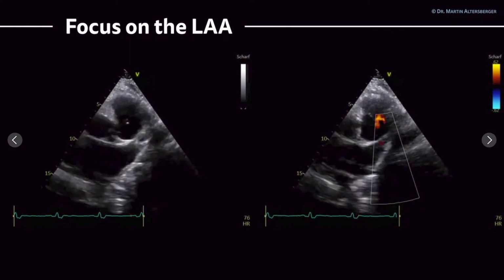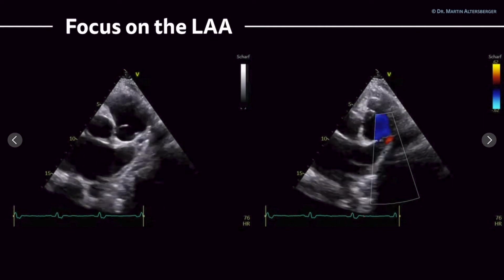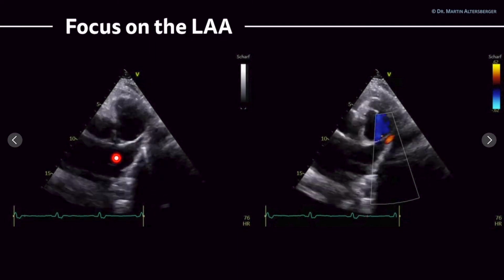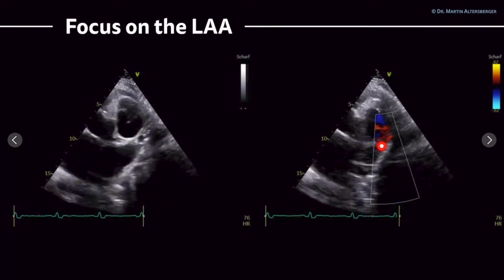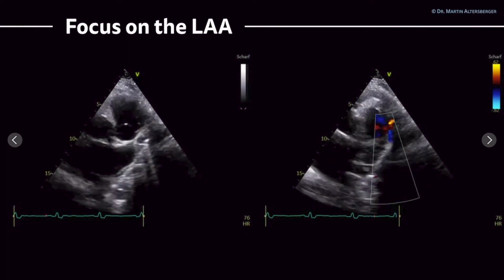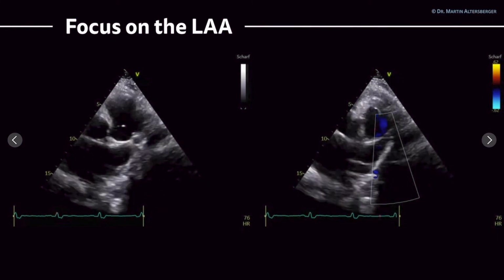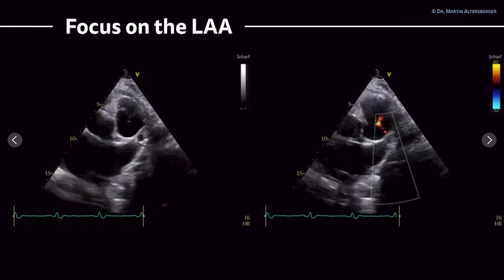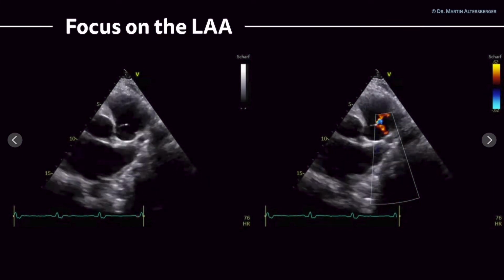And already you can see if a thrombus is present from TTE. More to focus on the left atrial appendage, so this is a specifically focused view where you can see bigger parts of the left atrial appendage, and you can use color Doppler where you see that blood flow is until the end where we can visualize. So in this case, there's probably no large thrombus present in the left atrial appendage. Simply keep that in mind if the left atrial appendage pops up, that you think about it and that you already can quantify it to a certain extent.